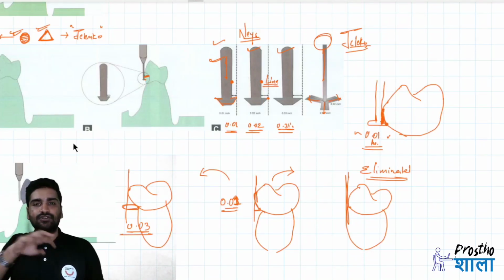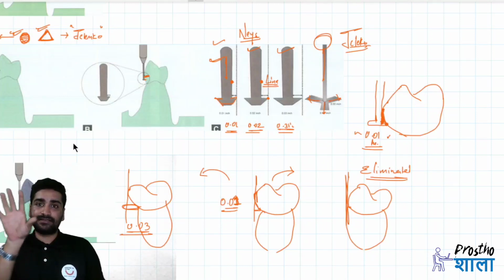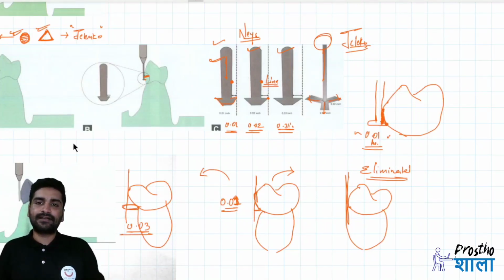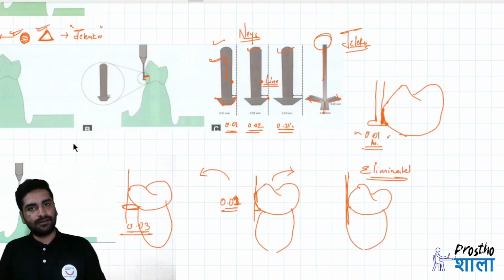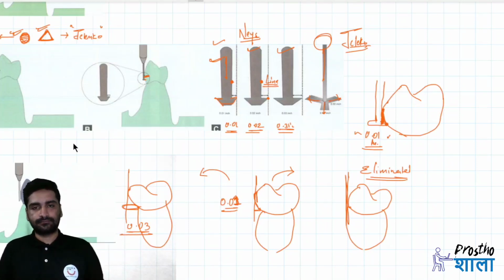So nowadays you design the prosthesis or the design of an RPD in the software. You directly press enter in the computer, it goes to a metal sintering device or a milling machine. There the metal itself will get trimmed according to the design and you can get it very quickly. Before, initially it was casting, but still metal trim, the milling of the metal also takes time.